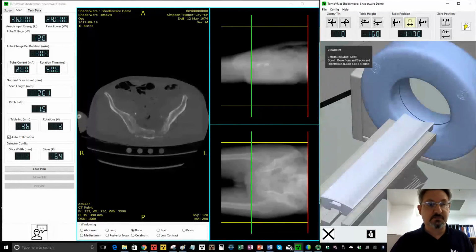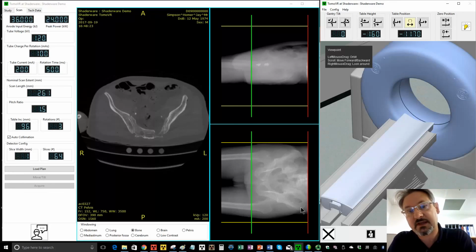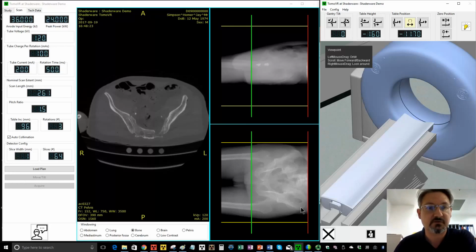Lots of questions you may have, in which case please book an appointment to talk us through the fantastic potential this will have for teaching your students in the future. It's one of 4 of our simulators that we have. We also have a projection radiography simulator. We have a physics simulator that simulates the X-ray beams of mammography, fluoroscopy, and really goes to detail about all of the quality assurance criteria, and we have a lecture VR, which is a radiographic anatomy simulation as well.